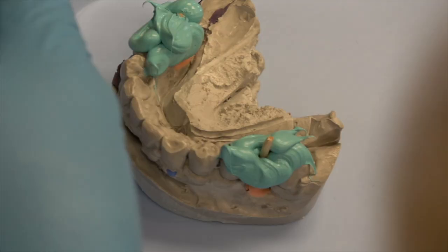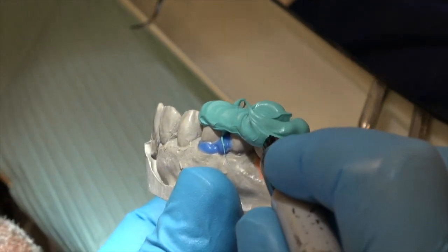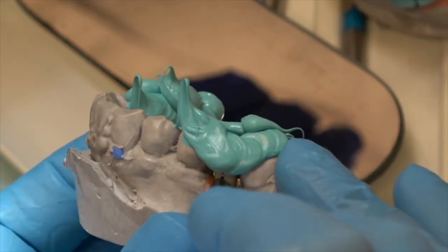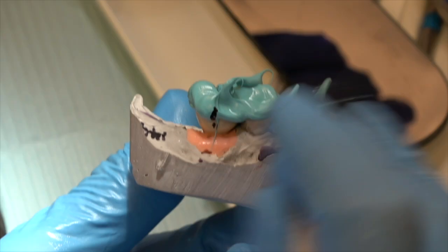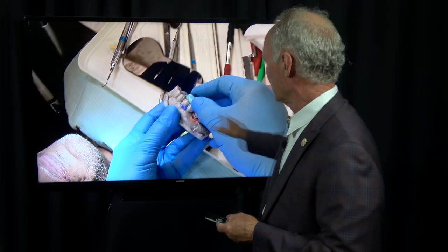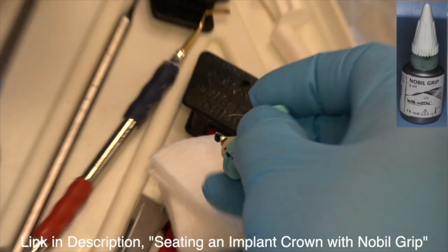Just remove the stick. For extra safety, I put a magic marker dot on the seating jig and line it up with a magic marker dot on the crown, just so I know for sure it hasn't turned. You don't really have to do that, but I'm super safe — I don't want to have to even think about it. Also, you may want to cut the top part of the seating jig off so the flared part doesn't keep your screwdriver from fitting into the hole.